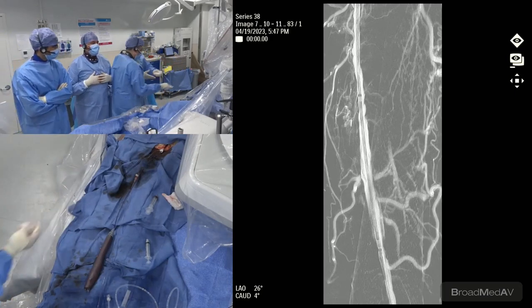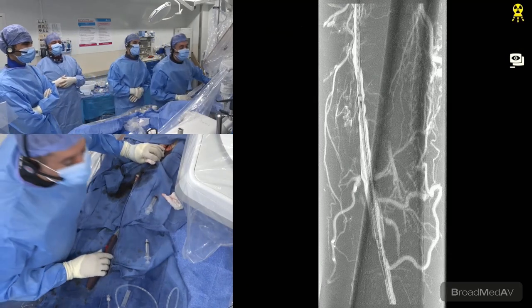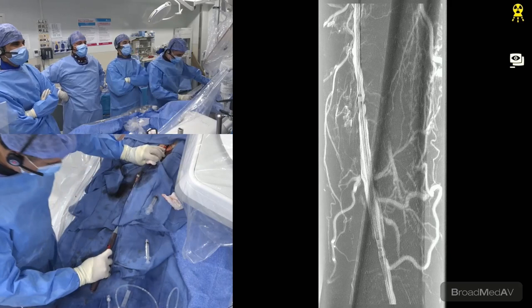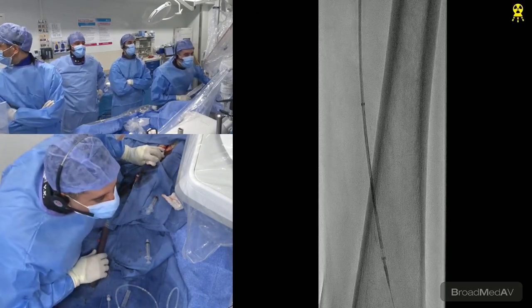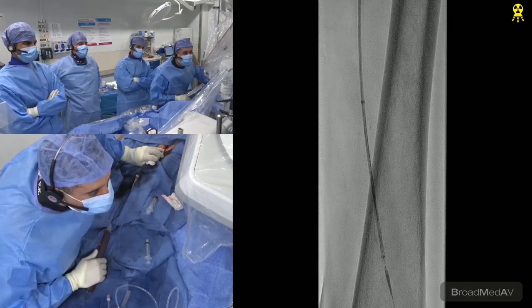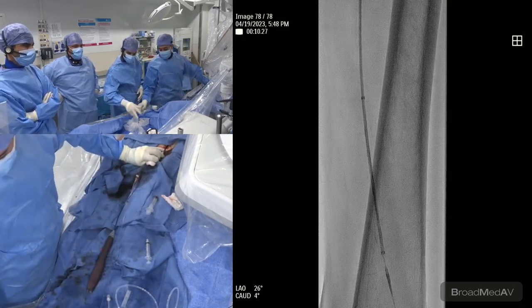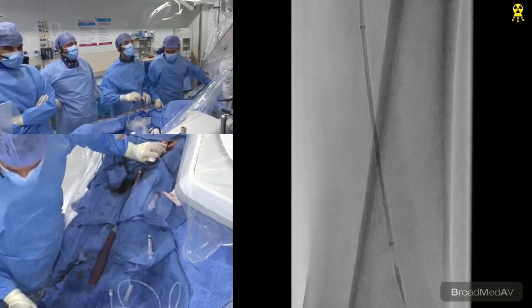Go ahead, Vishal. I want you to deploy it. So we're going to get Vishal to deploy it. Everybody's fighting over deployment. So, guys, when you deploy, very important. Vishal's going to get it going first. Once he gets it going, we're going to go ahead and deploy the Supera. He came off roadmap, but he wants to stick the landing zone. So you want the Supera to come out.